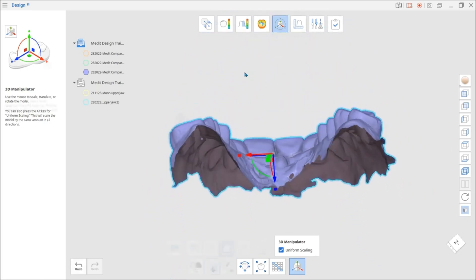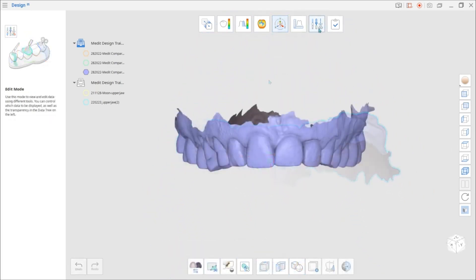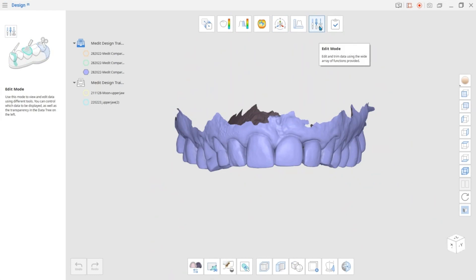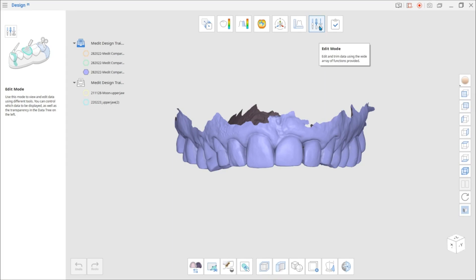And the last mode that we are going to look at is the Edit mode. We provide a wide variety of tools that can be used to view, trim, and edit data.